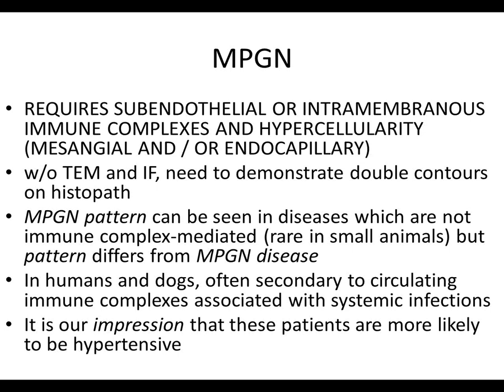So I'm very upfront with the clinicians that submit the biopsy by saying, look, it has a pattern, but I need the additional studies before I can definitively call it. And I think there's nothing wrong with you guys doing that, especially if you're out in practice and you're reading for IDEXX and you have an impression that this is what it is. But you're exposing the dog to potentially very expensive and sometimes dangerous immunosuppressive therapy. So that's why we're trying to be a little more straightforward about whether we do know it or we don't know it.